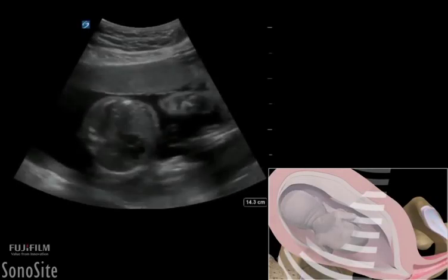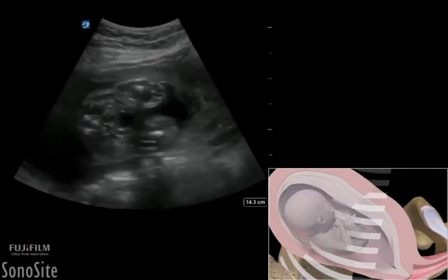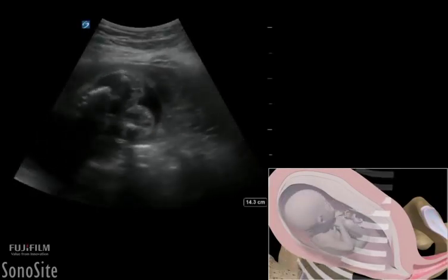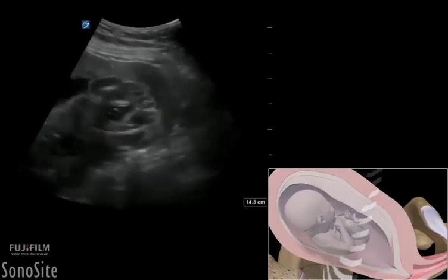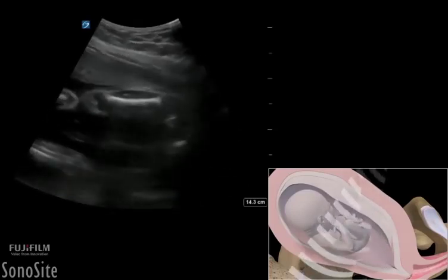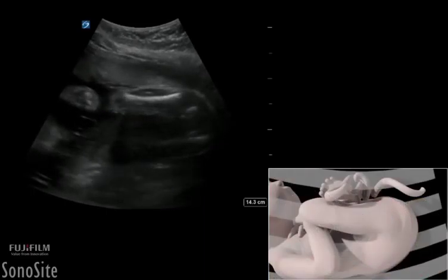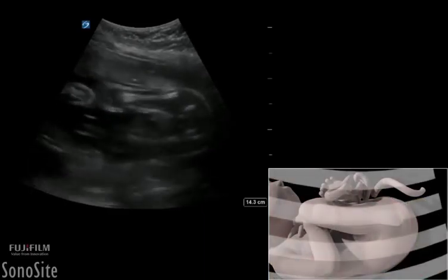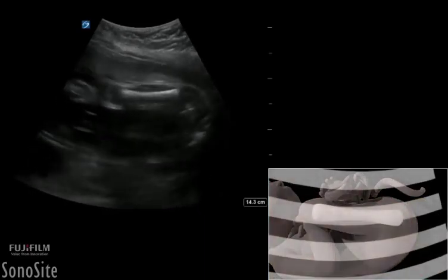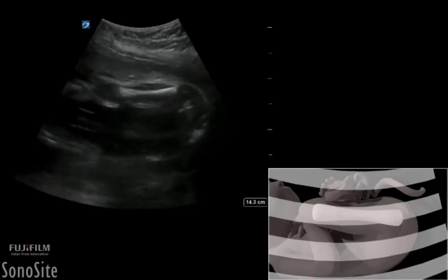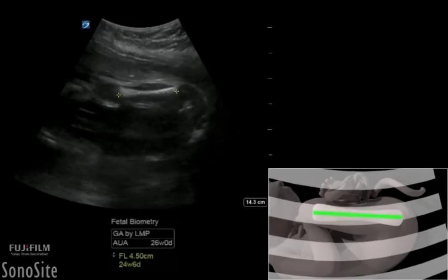The femur length measurements are performed by sliding the transducer caudally along the fetal spine and pelvis, then angling off to image the hyperechoic diaphysis of the femur longitudinally. By placing the most anterior femur horizontal to the ultrasound beam, the calipers should be placed at the ends of the bony diaphysis and exclude the greater trochanter, the distal femoral epiphysis, or any triangular spur artifacts that can falsely increase femur length measurements.